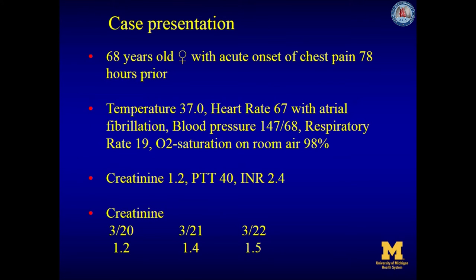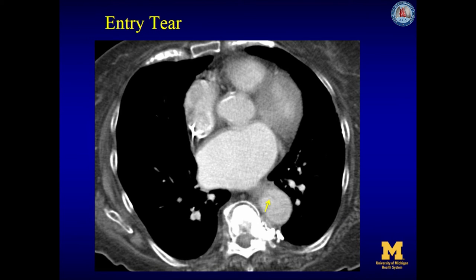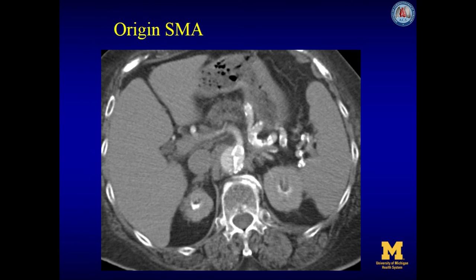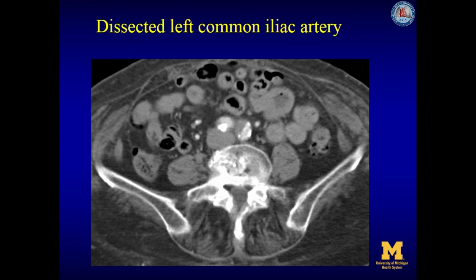She also had markedly diminished pulses in her legs and requires intervention for correction of the malperfusion. Initial CT imaging reveals part of an entry tear at the mid thoracic descending aorta, as shown by the yellow arrow. CT imaging demonstrates a collapsed true lumen with the superior mesenteric artery coming off the true lumen. CT imaging of the common iliac arteries shows a dissected left common iliac artery, while the right common iliac artery is not dissected.